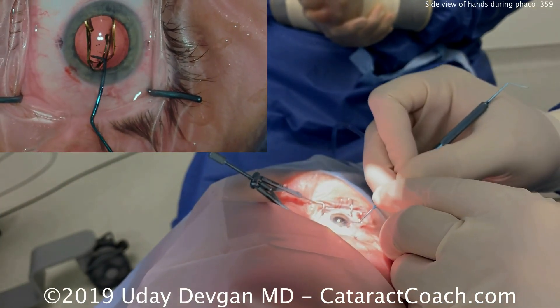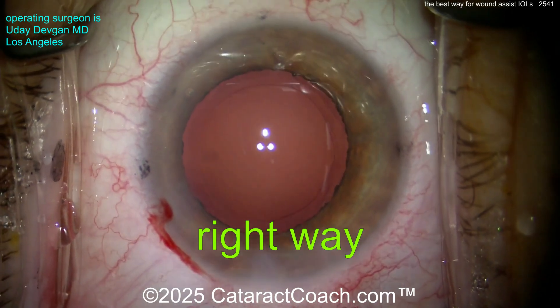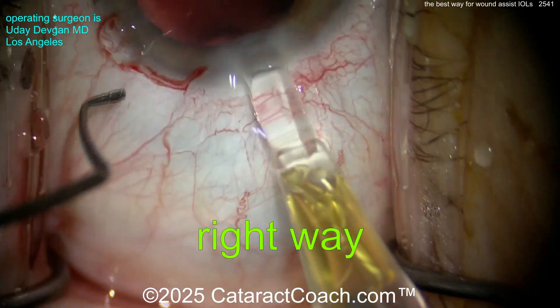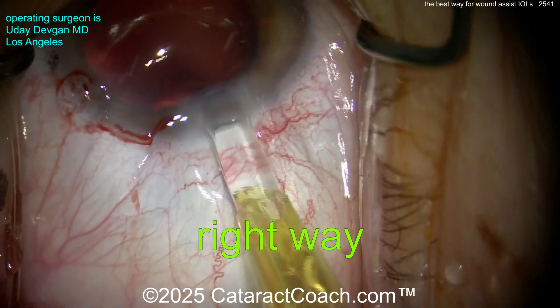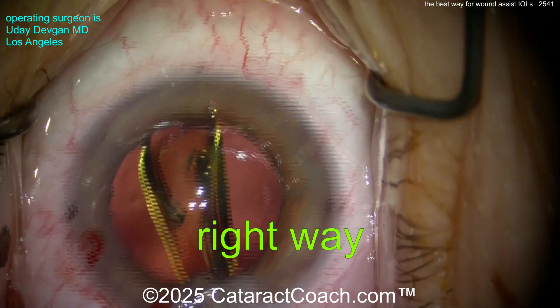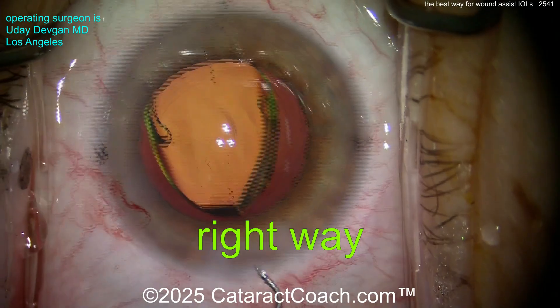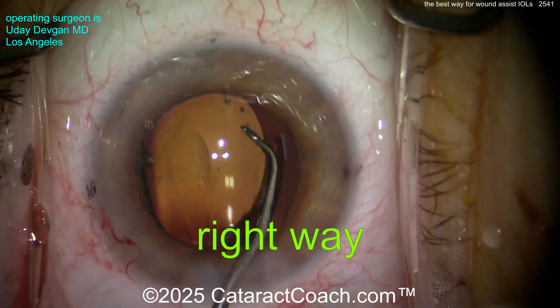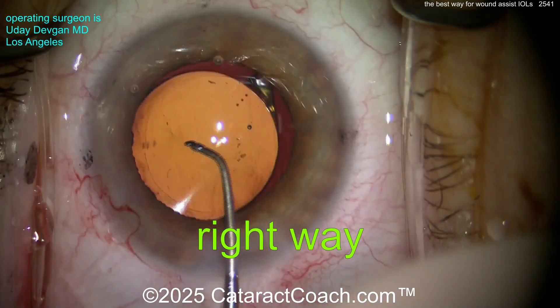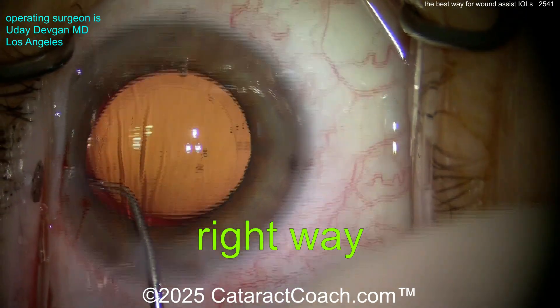The main issue people have is with a two-handed injector, because you can't fixate the eye. So let me show you one last time — the right way. Two-handed injector: get the tip right there against the incision. The eye is a little bit in the nasal canthus, but as soon as the lens starts to go in the eye, bring it back to primary. Get the lens fully delivered while you maintain your view. Remember, this is how you use the incision and do the wound assist, especially with a two-handed injector.